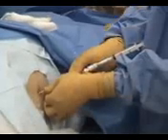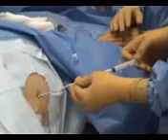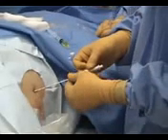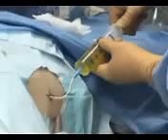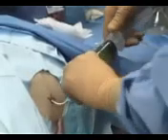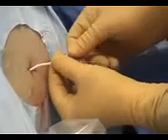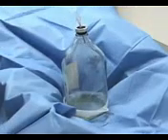You may feel a sudden loss of resistance when the needle pierces the peritoneum. Immediately stop advancement once the ascitic fluid begins to fill the syringe. Next, guide the plastic catheter over the needle and into the peritoneal cavity, and then remove the needle. If a diagnostic sample is required, attach a large syringe to the catheter and aspirate 30 to 60 milliliters of fluid for analysis. For therapeutic large volume paracentesis, attach the high-pressure tubing to the end of the catheter and then to an evacuated container. Further containers may be used for collection of fluid if necessary.